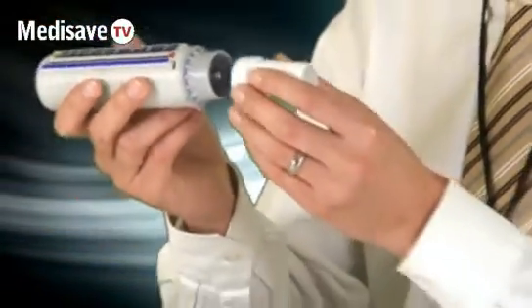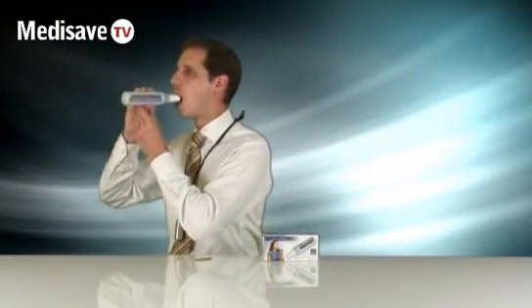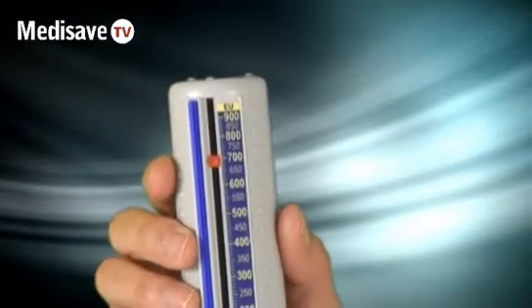It comes with a reusable plastic mouthpiece which you just pop in, and if you watch the zoning on there — short sharp bursts — you can see the indicator has gone up to 700 litres per minute.